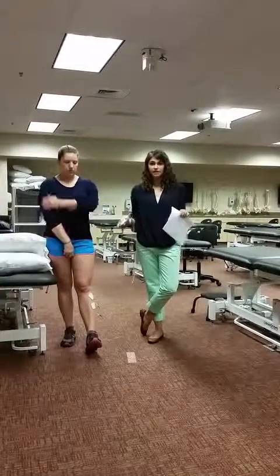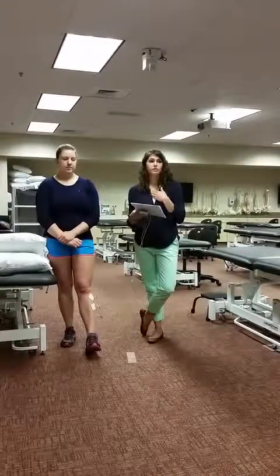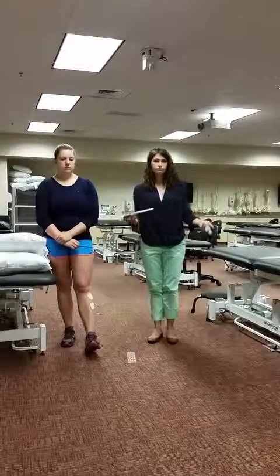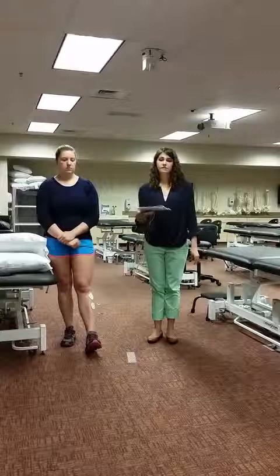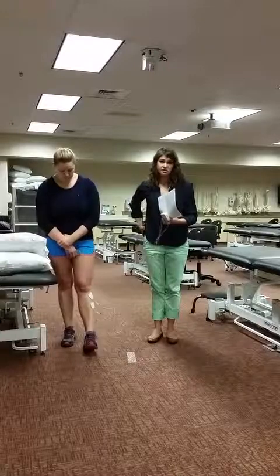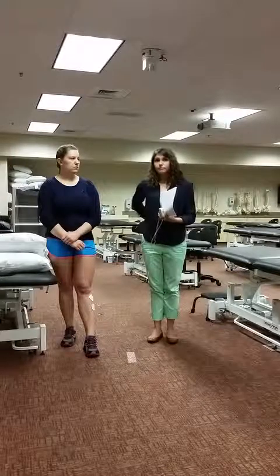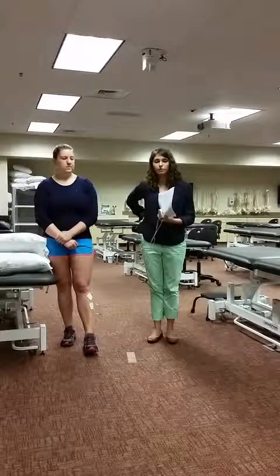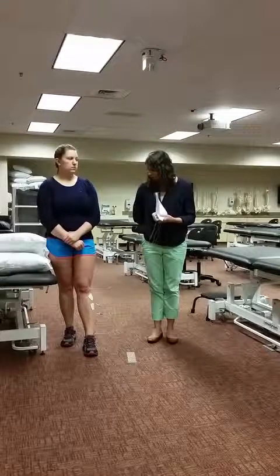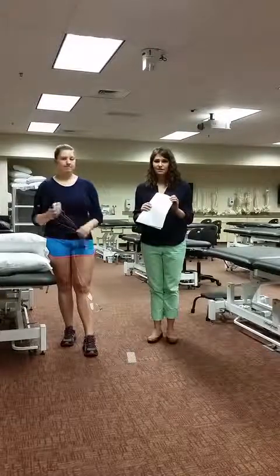An increase in gait speed, especially moving from one speed-based classification to another, gives a large improvement in quality of life and an increase in independence, and also decreases fall risk. Patients will also have better energy costs. Overall, dual channel FES could be very beneficial for a patient with chronic hemiparesis to help with cardiovascular function in daily life. Results will vary from patient to patient, but it could definitely help improve outcomes in many areas. I would recommend dual channel functional electrical stimulation for a patient if you come across someone who could use it.